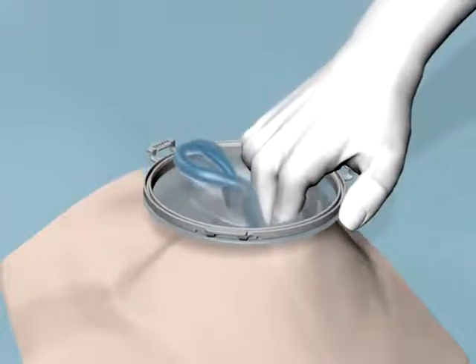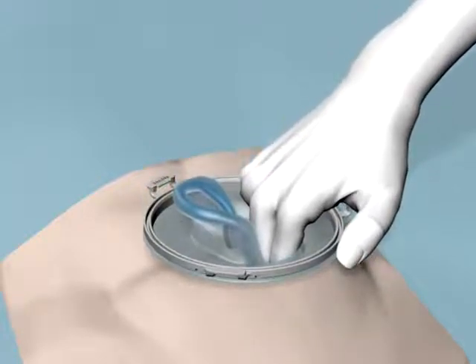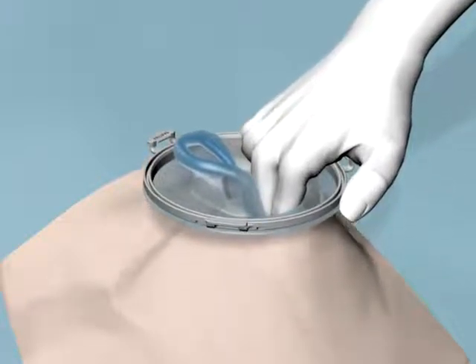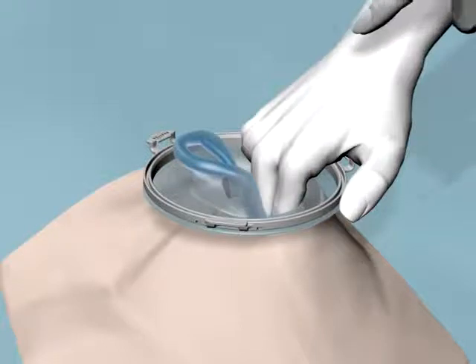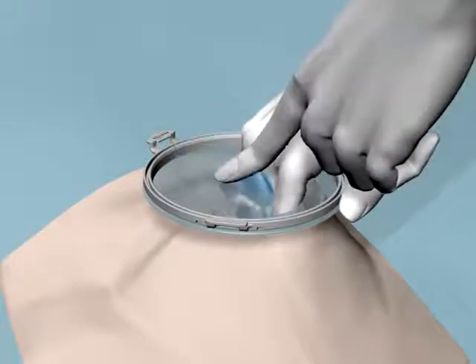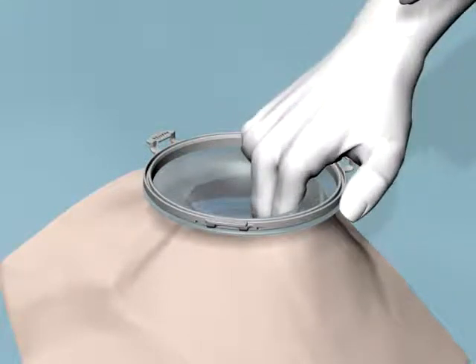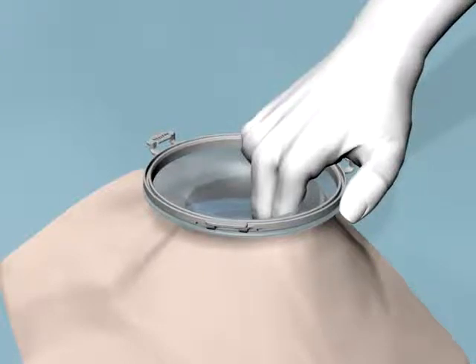Fixate with the middle fingers and thumb while concurrently elevating the abdominal wall. While elevating the abdominal wall, push the inverted portion of the bottom retractor ring back through the center aperture of the upper ring and into the abdominal cavity.